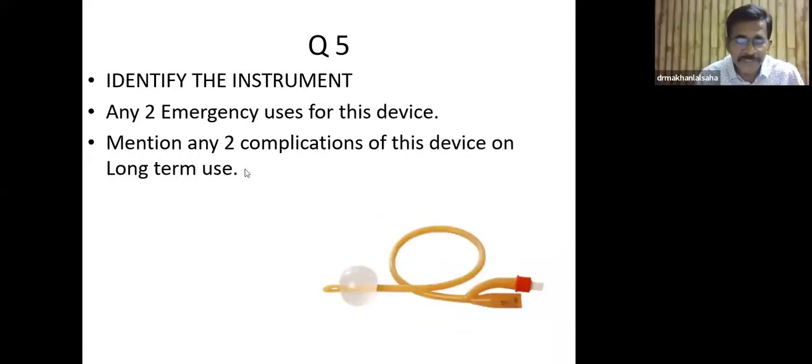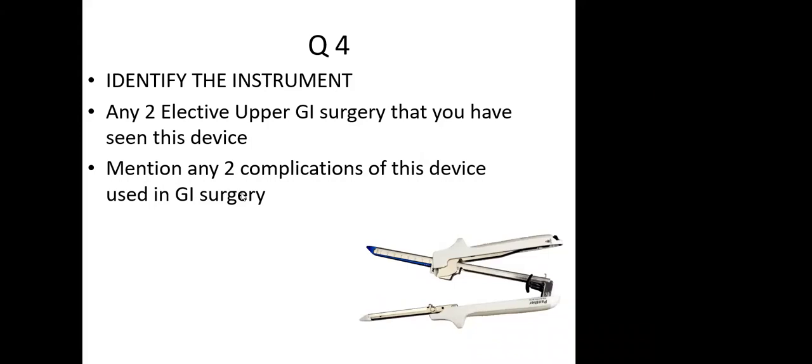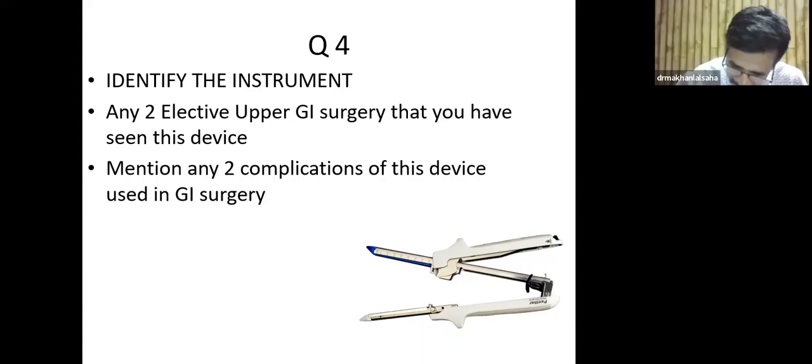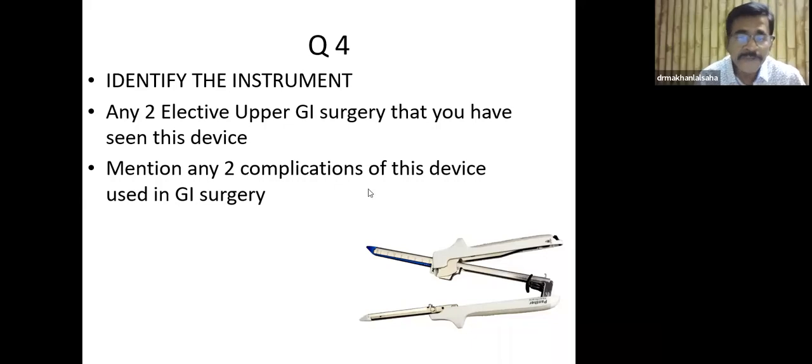And I have another question on the stapler. Suppose you have a 65 millimeter cartridge. You fire. How much will it cut? How much will it staple? Sir, it will staple 65 mm, but it will cut 2 millimeter less on either side. Very good. So 61 millimeter will be the anastomotic opening, and you staple 65 millimeter. That's good. Okay. Next. Thank you, sir.